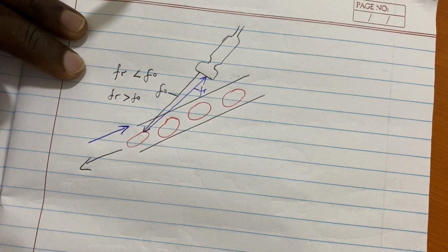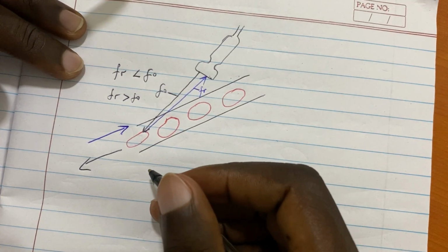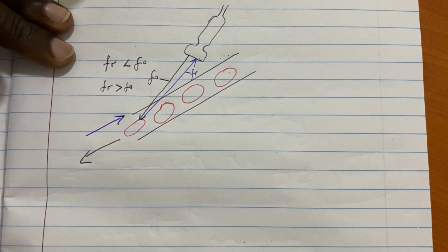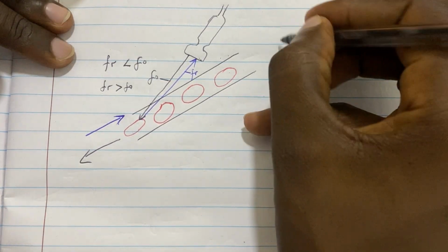You see, in echo, things are not like this, how we see them. This Doppler shift has an angle component.